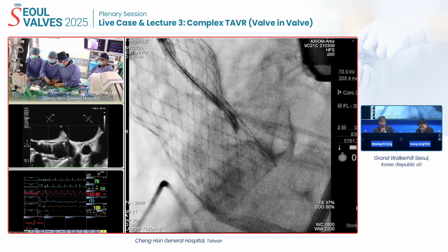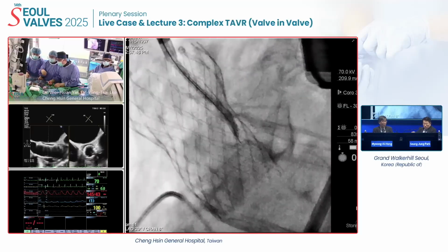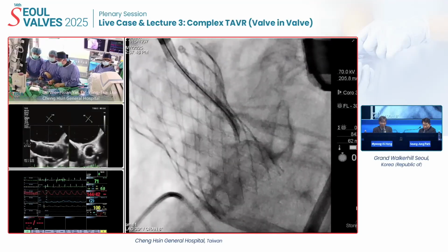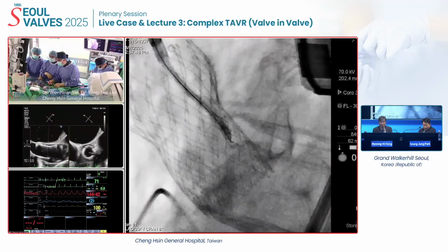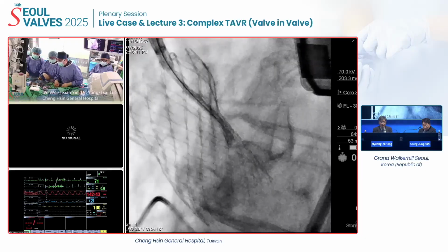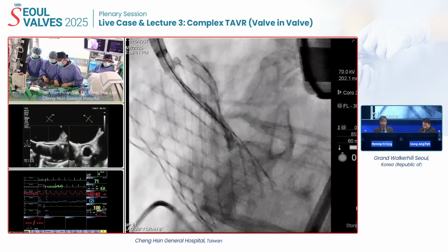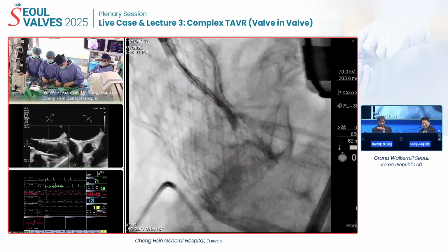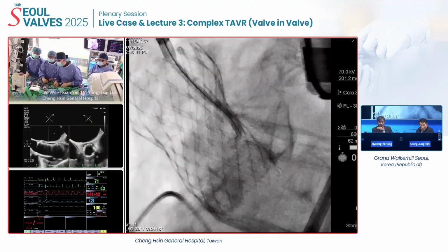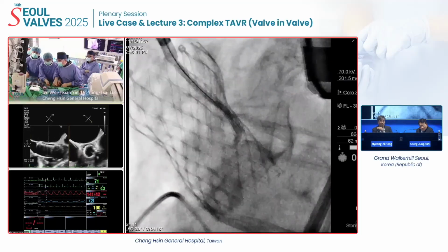So what are you doing now? Wei-Hsian, what are you doing now? Please explain. The sound transmission is not good. Okay. On the fluoroscopic findings, please tell us what you are doing now. Pardon? What are you doing now?